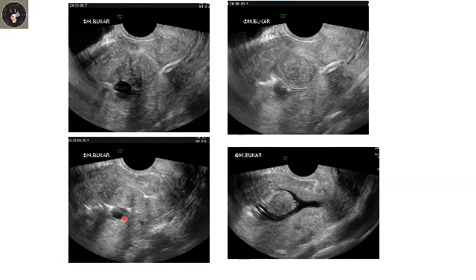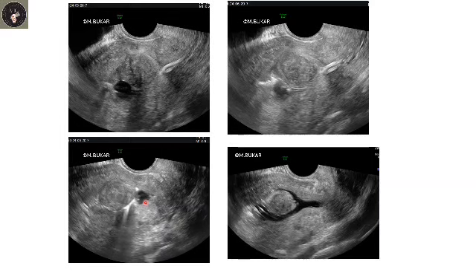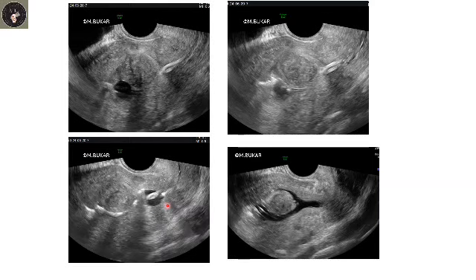Look at this video. Look at where the catheter balloon is. And shortly you see that the assistant will pull the catheter balloon lower down to its rightful position around the level of the internal os. So look at this. So assistant is pulling. You see this? To its rightful position, which is where?